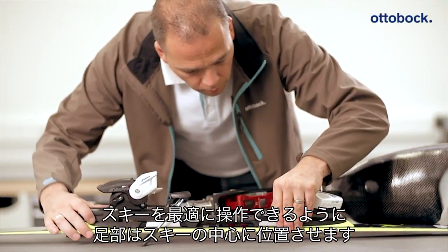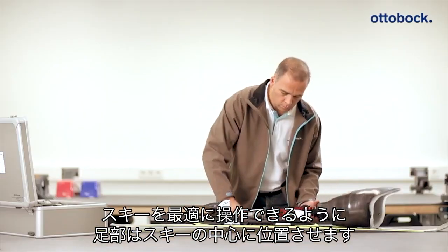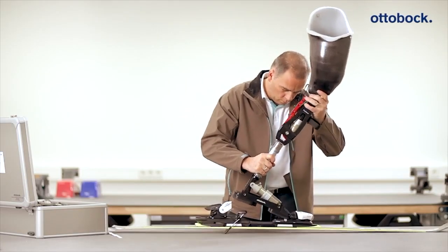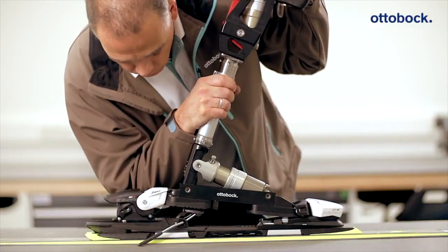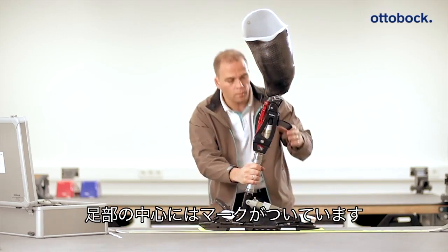It is necessary to ensure that the ProCarve foot is positioned in the middle of the ski so the ski has optimal movement properties. A corresponding marking is found on the ProCarve foot.